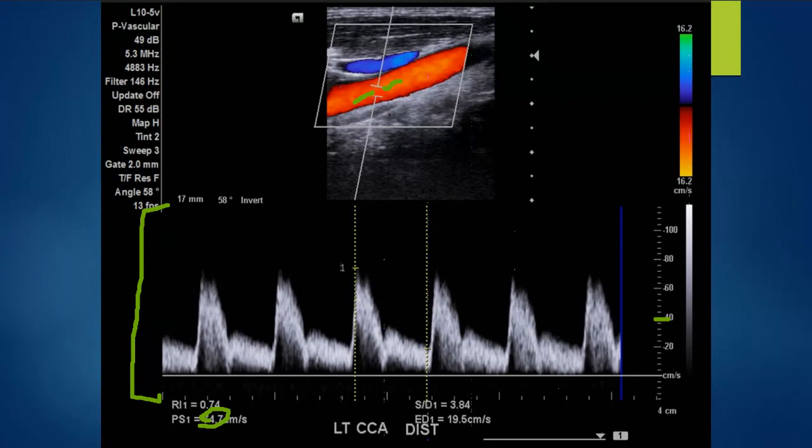This whole waveform is going to be kind of zoomed in on, and we're going to be cutting off this whole region of that waveform. And what's going to happen to all of this information above that limit? It's going to pop up on the bottom of our screen and occur in what we call aliasing. So we'll see that on our next slide. But I think that was all the information I wanted to show.